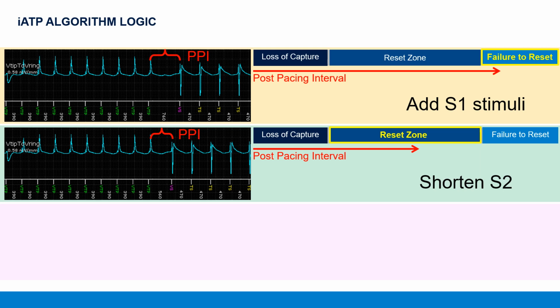And so it can recalculate using that formula we alluded to before, that the post-pacing interval, when you've reset the tachycardia, includes 2 times the electrical distance, meaning the time to get to the circuit and the time to get back, plus the tachycardia cycle length itself.